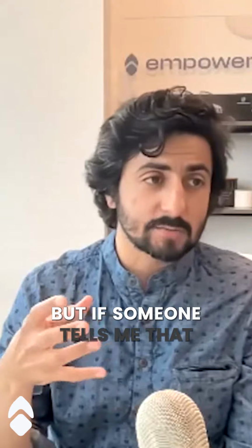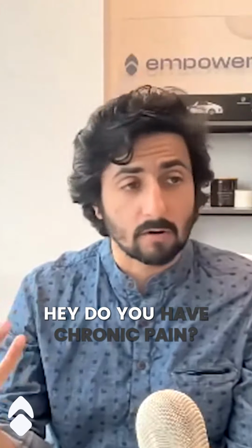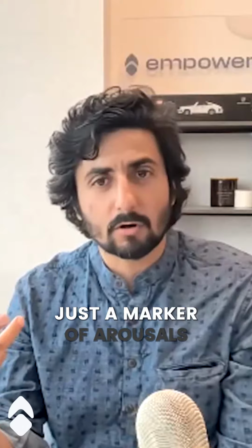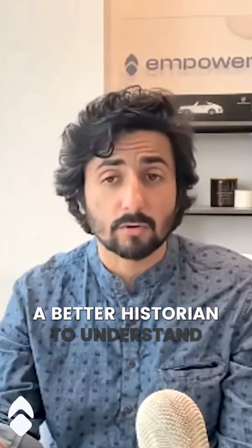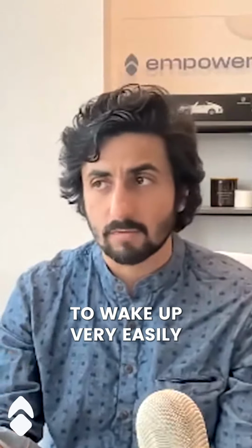But if someone tells me that they don't snore, they think that they sleep well, there are no witnessed apneas, the RDI is high, then I'm looking for symptoms. Hey, do you have chronic pain? Do you have chronic anxiety? Because in that situation, that RDI is just a marker of arousals over the course of the night. My job becomes to be a better historian, to understand what are other things that can be causing this person to wake up very easily over the course of the night.